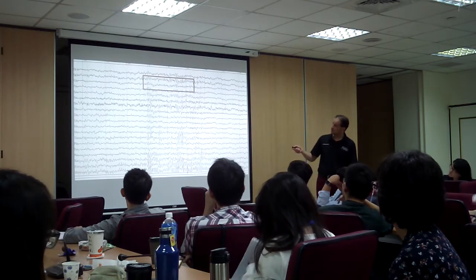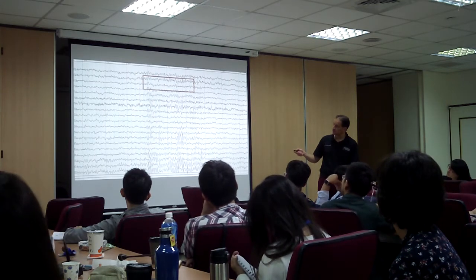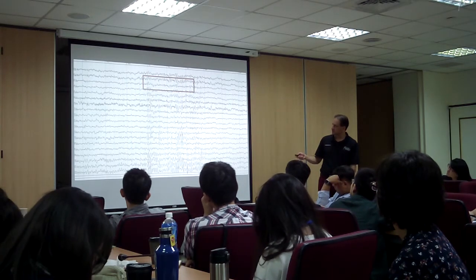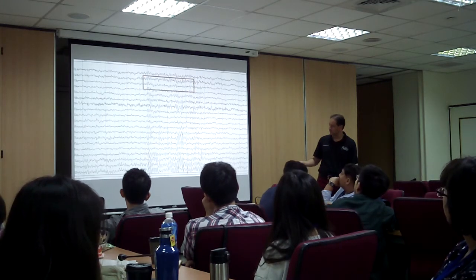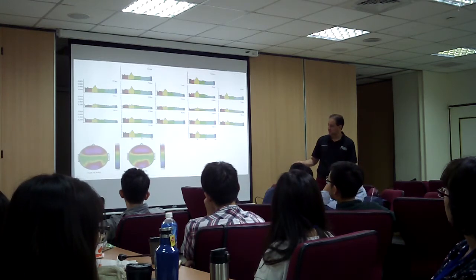So here's a clear example of an EEG with a dysregulation of the prefrontal cortex, some theta rhythm, fast alpha rhythm going on, and then we'll read that later. Don't worry about that. It's just to show you. And that's the hypercoherence. There's hypercoherence in the EEG, frontal to occipital, and those are the maps for hypercoherence, which shows it here at a fast alpha rhythm.